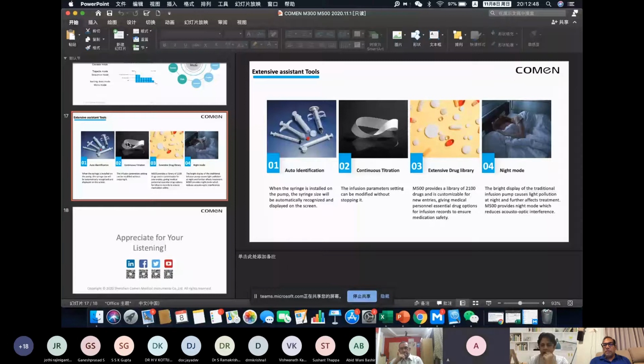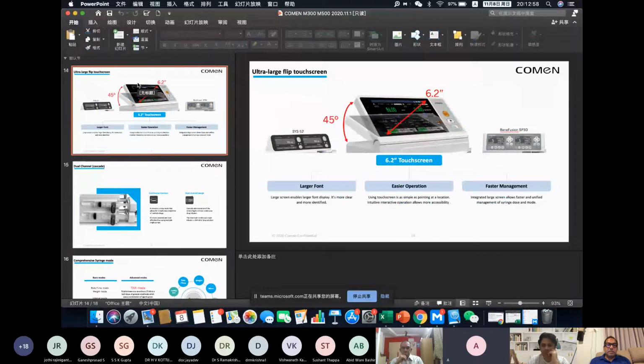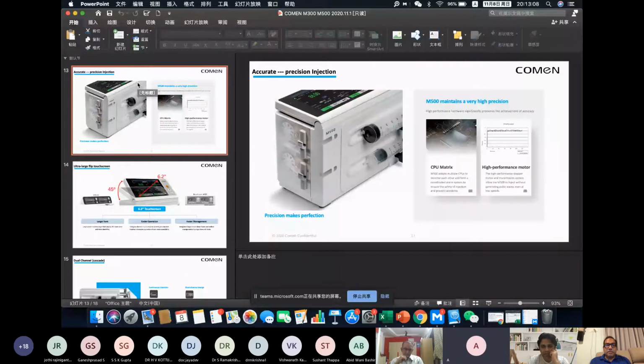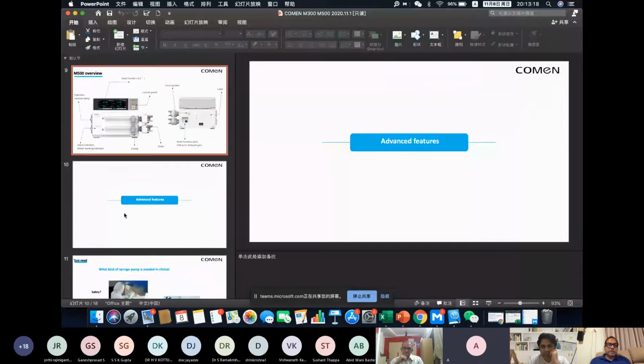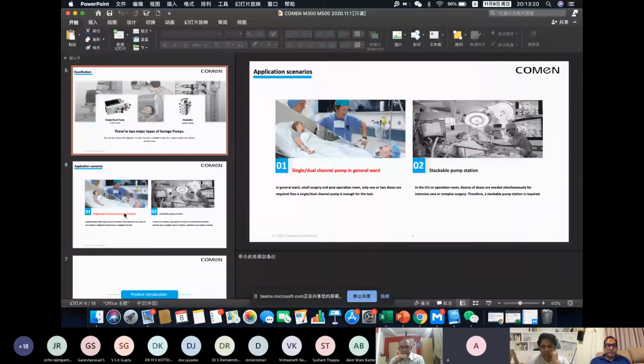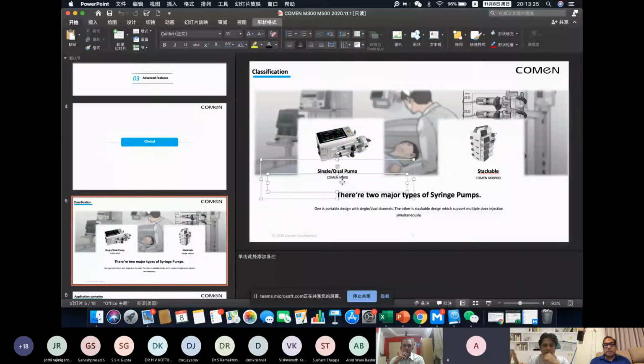It means we can connect to Wi-Fi, or we could have wire and wireless option to connect the CMS. For the single channel and the dual channel, we have only wire, means the cable. Okay, and for the workstation, let's go up. For the workstation, then we can do wireless.